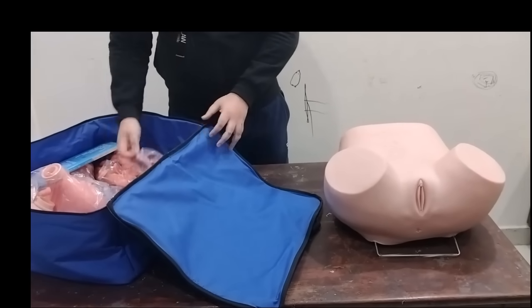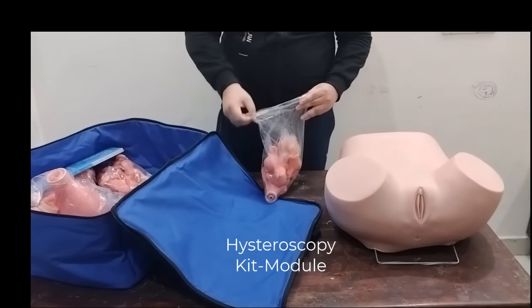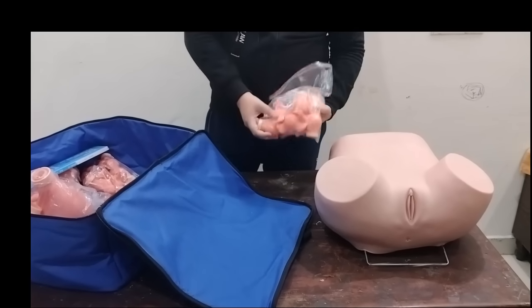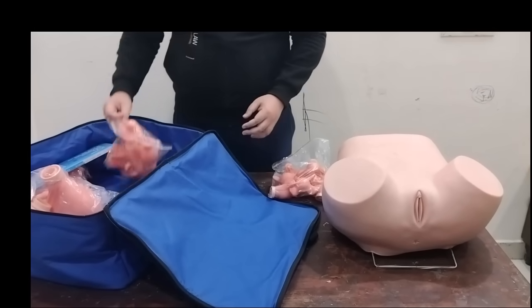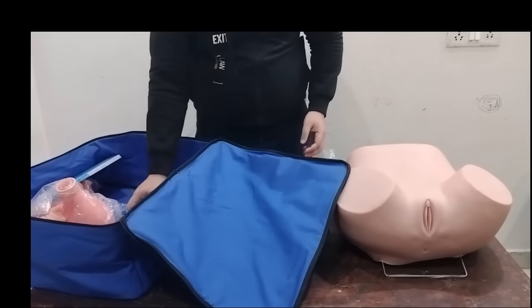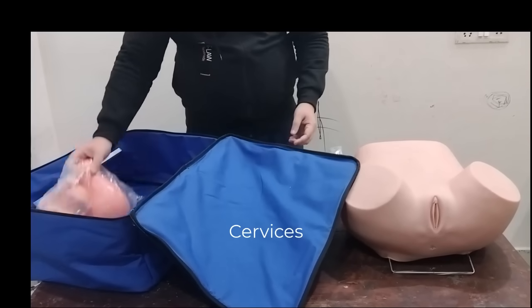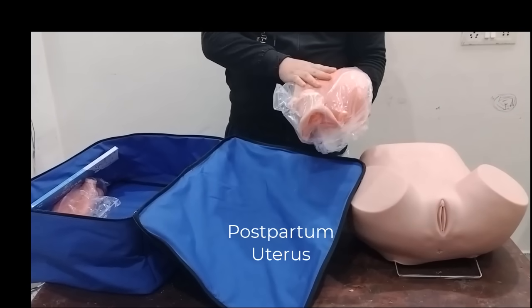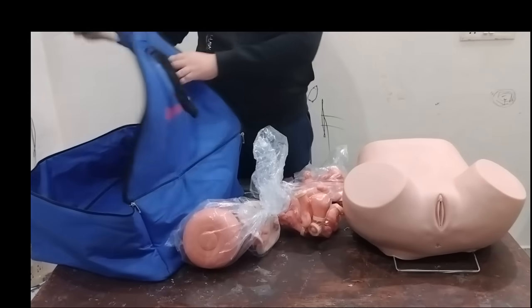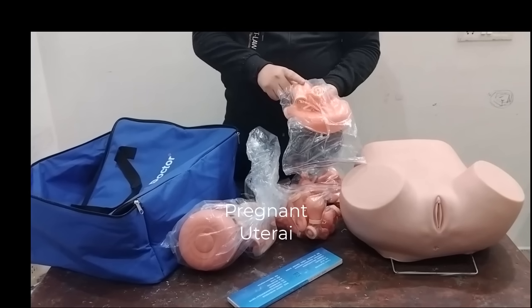Other than that, it has a hysteroscopy kit that can be viewed using a hysteroscope, a palpation uterine kit, one postpartum uterus, an IUD, and three early pregnant uterine models.